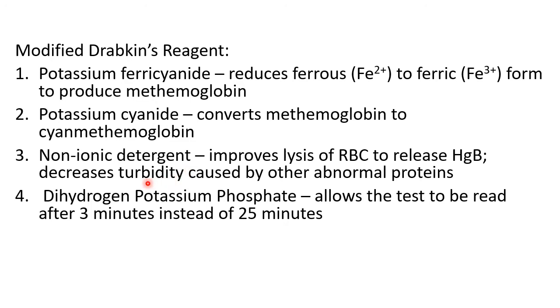Turbidity kasi will disturb the determination by spectrophotometer. And lastly, your dihydrogen potassium phosphate will allow the test to be read after 3 minutes only. Kasi normally or previously, mas matagal to, no? More than 25 minutes, supposedly. Itong reagent, mapapabilis niya yung process of reaction ng 3 minutes lang.